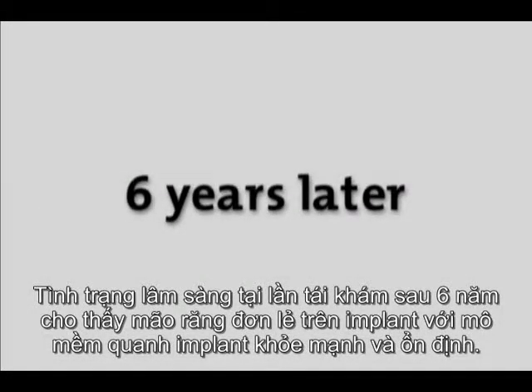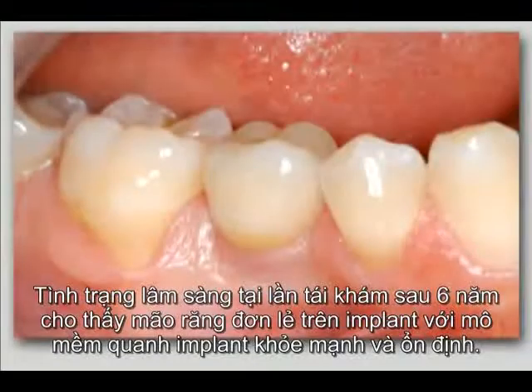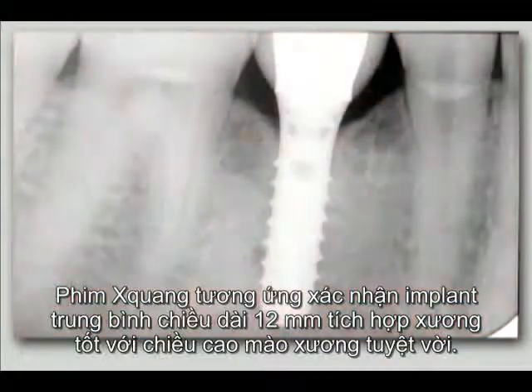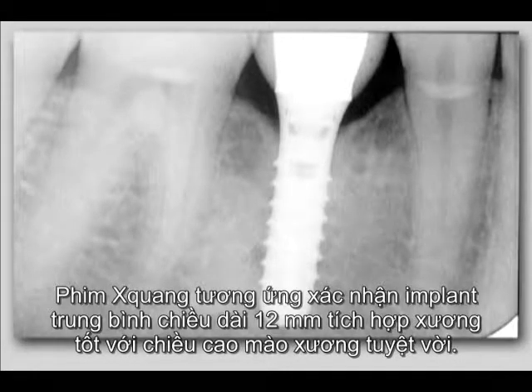The clinical status at the 6-year follow-up reveals the implant-supported single crown with healthy and stable peri-implant soft tissues. The corresponding radiograph confirms a well osseo-integrated 12 mm standard screw implant with excellent bone crest levels.